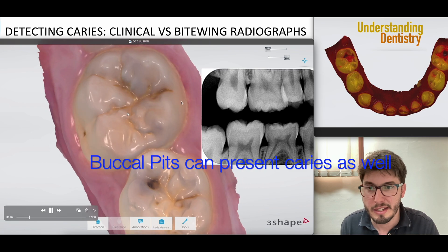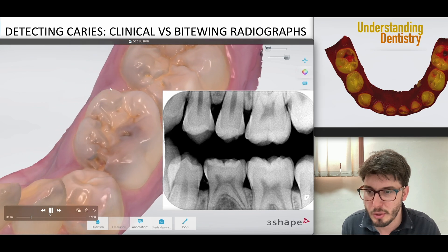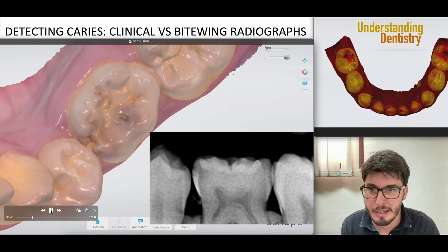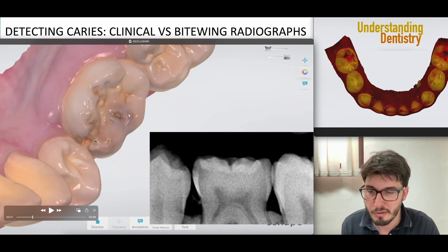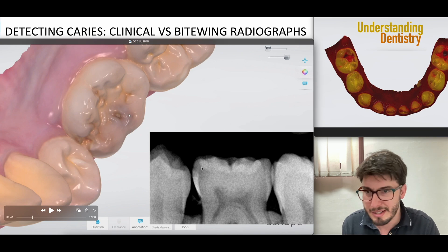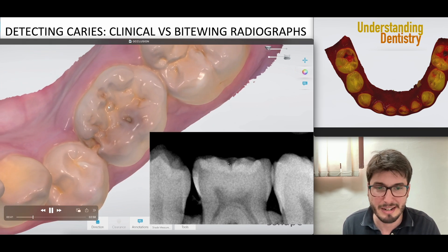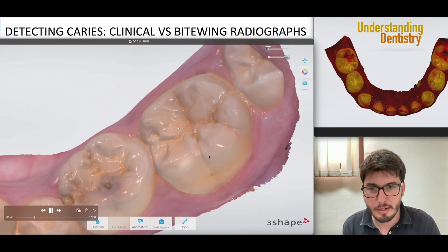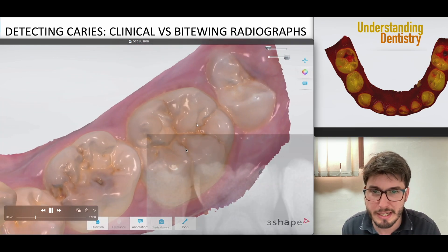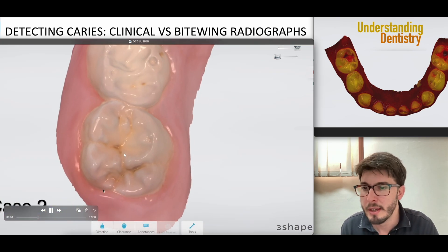Take a look at these fissures of the molar and now the other side. Here we have this mesial lesion — even with tooth wear there is a cavity. This is detectable because both enamel and dentine are affected. We are now seeing the other molar, which is fine. You can pause the video at any time to examine these cases.